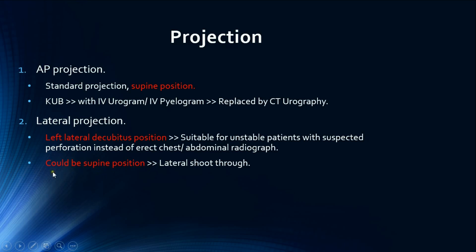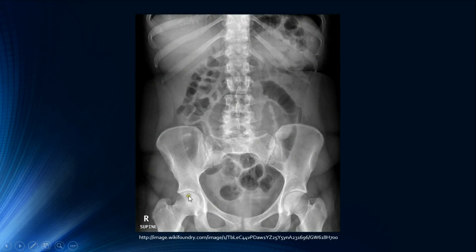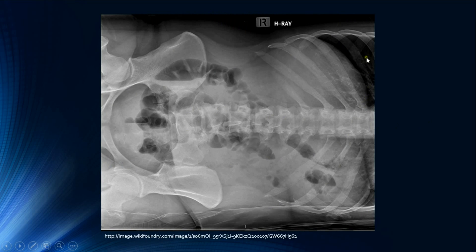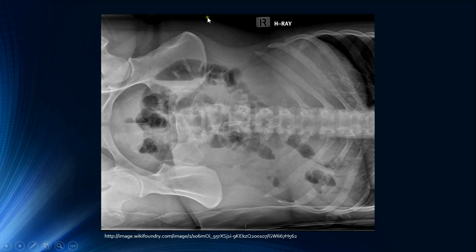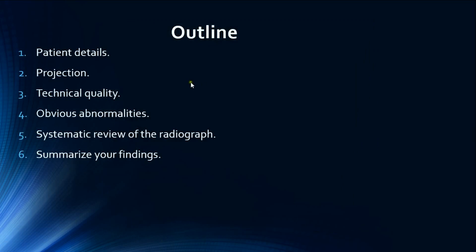Alternatively, the patient can be supine, which is called a lateral shoot-through. Here is an example of the standard AP supine projection. Here is a lateral projection in the left lateral decubitus position — you can see the liver as a dense homogeneous shadow at the top, with a marker indicating the right side of the patient.